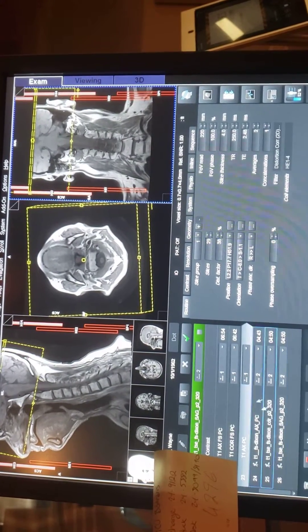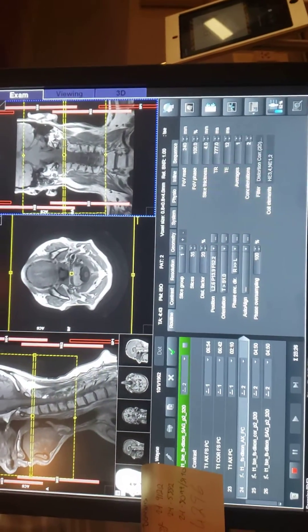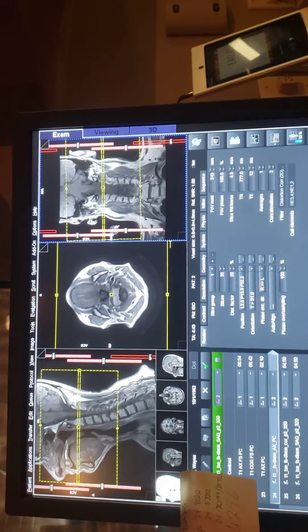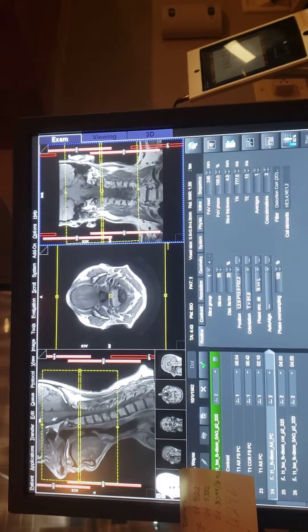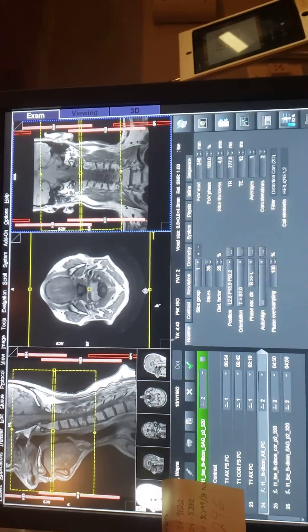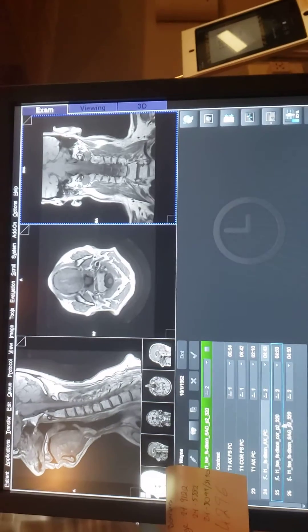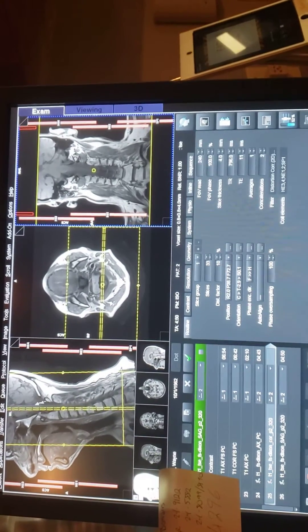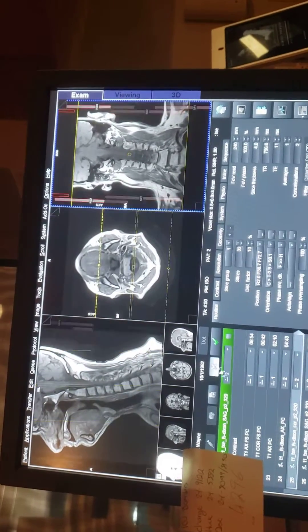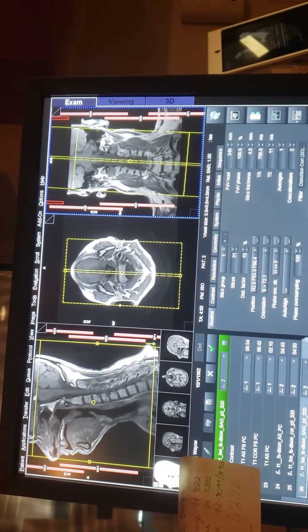That's where my axial is at, because it goes through the ears — that's why I got the middle of the ears. Then this was my coronal covering the middle of it, and then this is my sagittal. So it pretty much covers the whole neck soft tissue area.